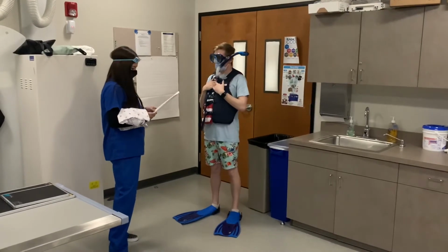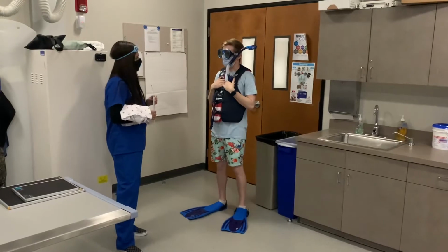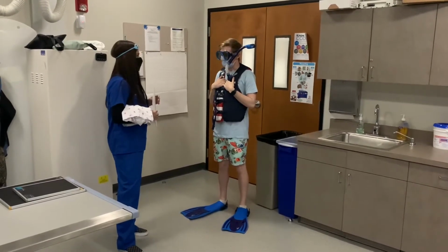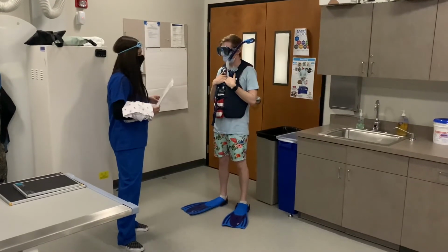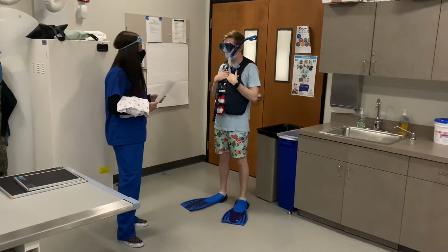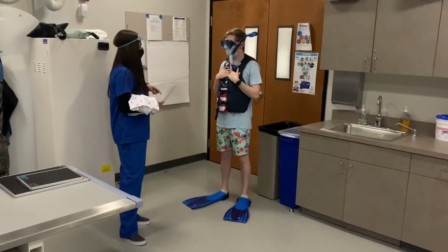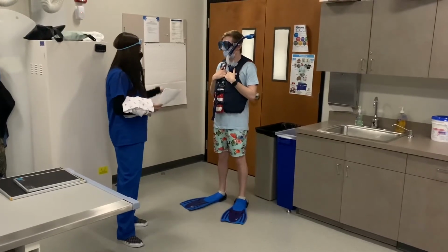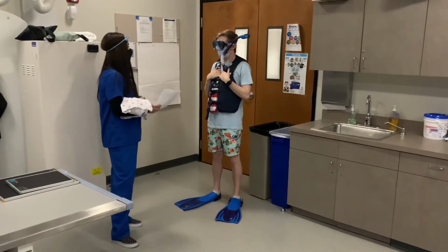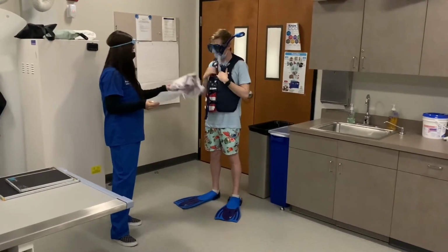Oh, wow, that was pretty scary. I'm glad you're okay. All right, how long has it been bothering you? It happened about 2 days ago. Okay, and anything that makes it feel better or worse? It's just kind of a generalized pain. All right, is it a sharp pain? It's kind of a throbbing. Throbbing? Okay, perfect. Well, we're going to do a projection of your neck, okay? So it's just going to be one view, but I do need you to take everything from the waist up off, and you can leave your flippers on, but your goggles and mask and your snorkel have to come off, okay? Okay.